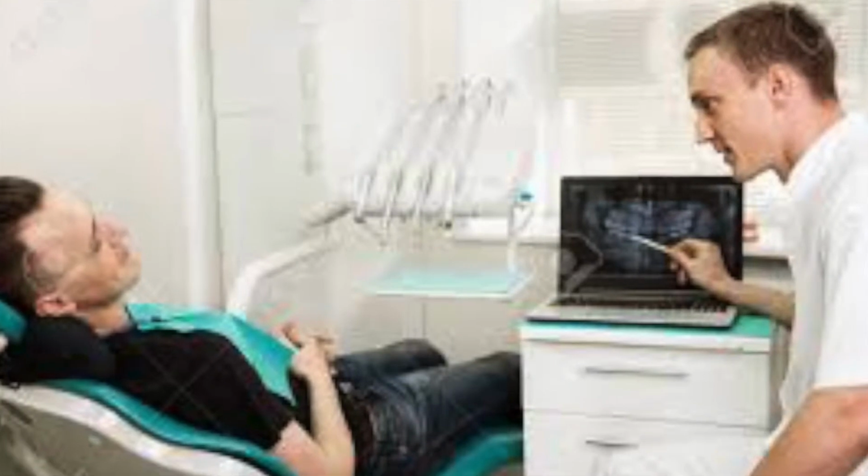So the purpose of radiographic images is that it enables the dentist to see any conditions that aren't visible by eye in the oral cavity and to identify any conditions that might otherwise remain undetected by the dentist or the dental assistant, such as diseases and conditions that have no signs or symptoms and are typically only discovered through using the dental images. So that's why it's super important to know how to use this machinery and the precautions to take while using it, because it is super important to the patient and the patient's history.